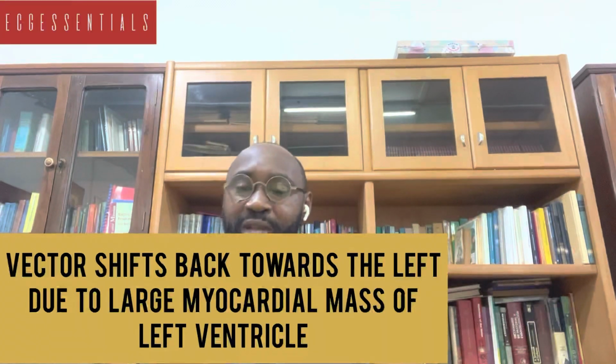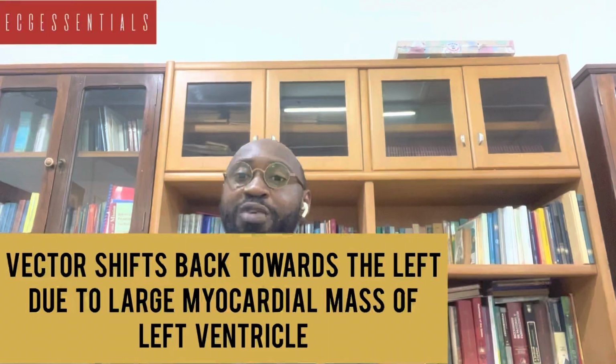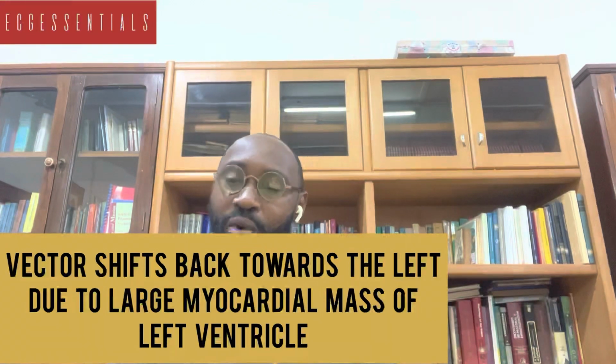So what this means is that the overall vector is now moving towards leads that are placed more on the left side. That is why we expect that leads on the left lateral side, see again lead 1, AVL, V5, and V6, will record very tall R waves or R deflections because the wave of depolarization is now moving towards those leads. Overall, the orientation is between the angles of 0 and 90.